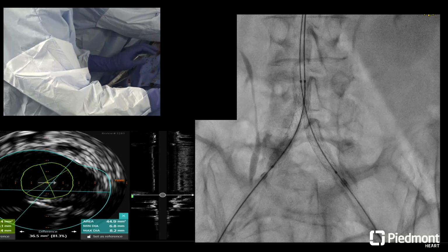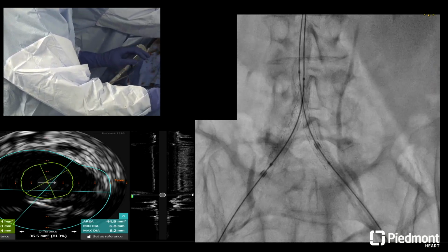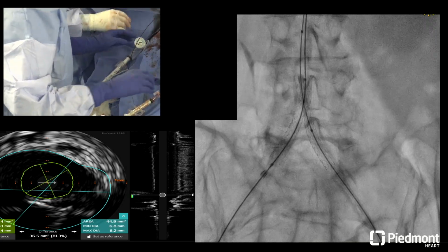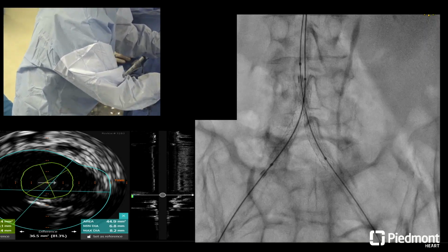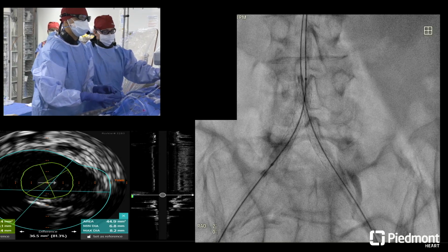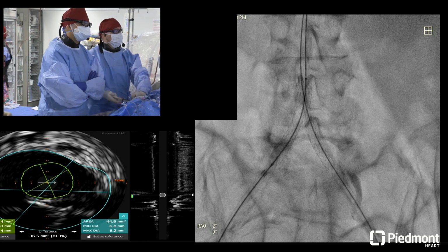In that respect, I'm definitely going to do this technique and use balloon-assisted tracking to get that up. So we have a picture from above. We also have a pressure from above. You want to back that out and leave it. And I always leave the balloon on the wire, in case I need to go back up with a rupture. First thing I'm going to look at here is her pressure, and it's still doing quite well. Thank you, God.